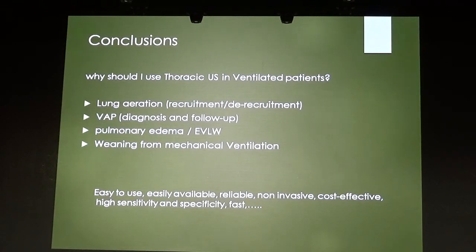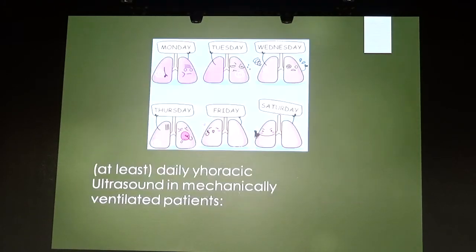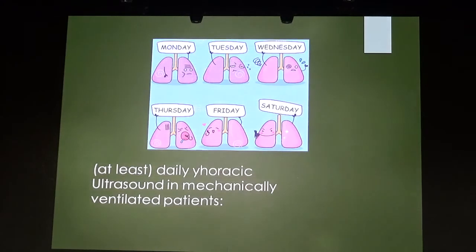We know it is easy to use, easily available, reliable, non-invasive, cost-effective, it has high sensitivity, specificity, and it is fast to obtain. So my question is, okay, so daily, routine use of ultrasound, of thoracic ultrasound, as we know that lung conditions can change every day and even many times a day, why not?